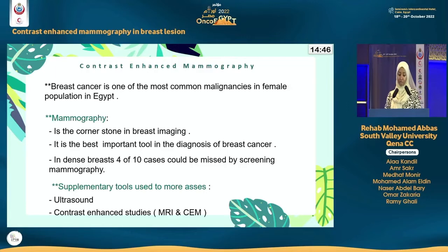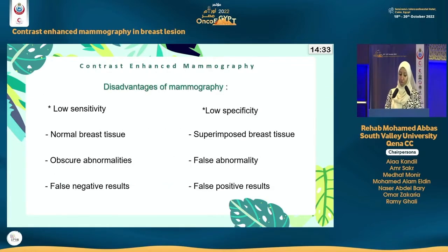4 of 10 cases could be missed by screening mammography. So we use supplementary tools used to more assist. We use ultrasound and contrast enhanced studies which is MRI or contrast enhanced mammography. The disadvantages of الماموجرافي انه بيبقى ليه low sensitivity و low specificity.